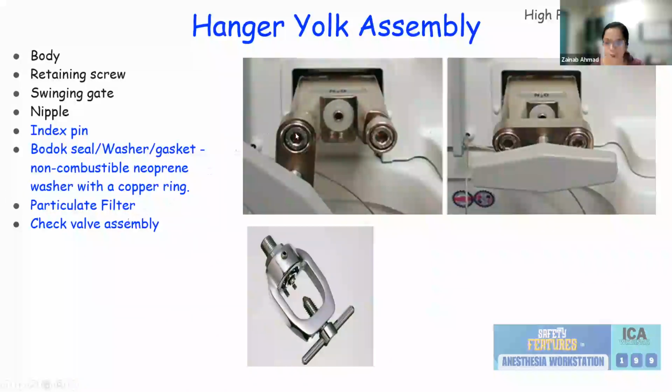Then a particulate filter is there so that, inadvertently, if there is any particulate matter in the gas, it is of size 5 micron. So anything above 5 micron will not go into the system and damage your machine or be delivered to the patient. Then we have a check valve assembly.